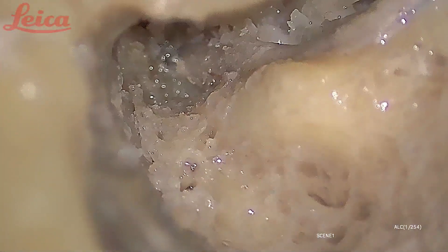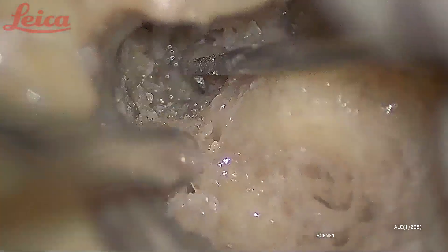This is the geniculate ganglion and almost the beginning of the first genu here. When I am lifting the nerve, you can see that the nerve is taking a turn — that is the first genu and the beginning of the labyrinthine segment.